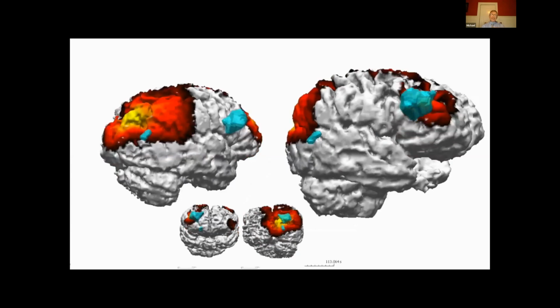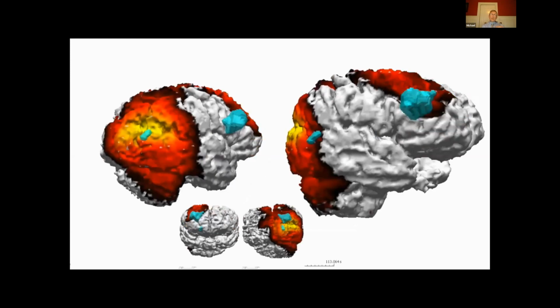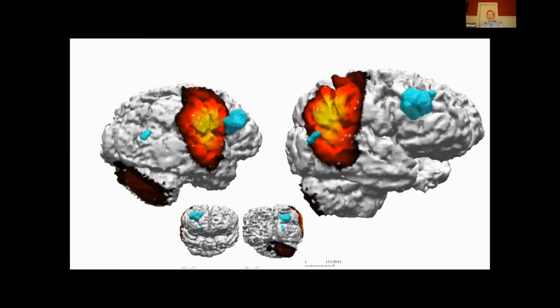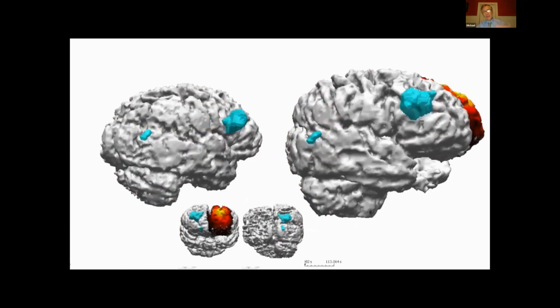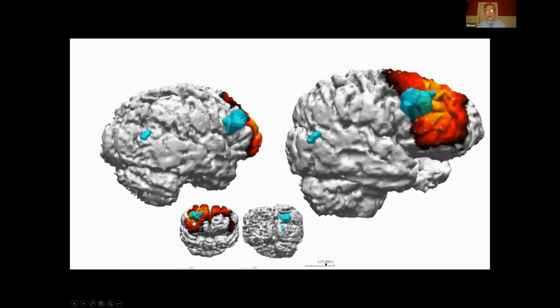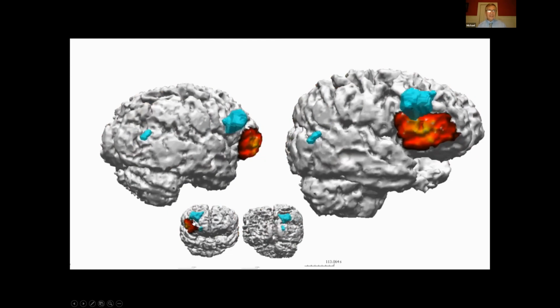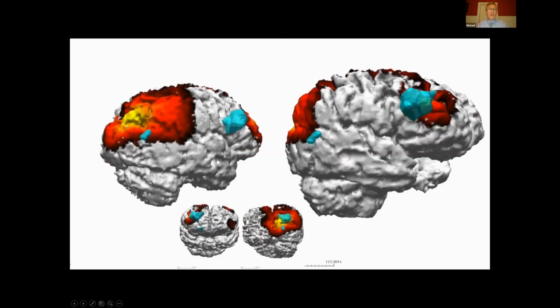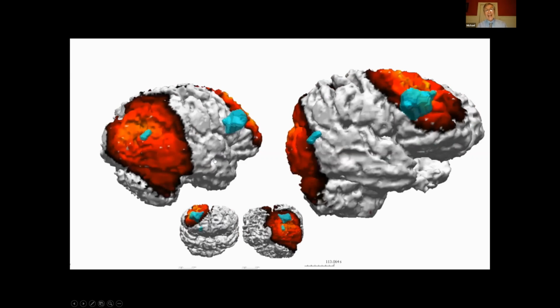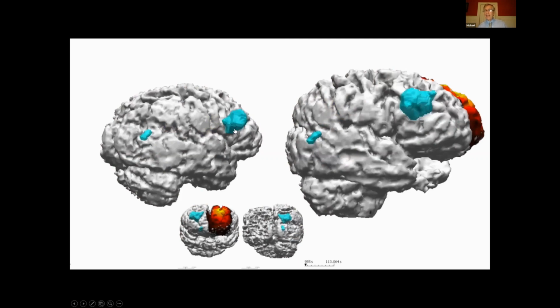The blue dots represent the fMRI denoted areas of increased activation, and the red yellow are those EEG patterns that are sweeping across the brain. And as you watch this video loop around, you'll notice that the EEG pattern is actually co-localized right over top of the fMRI patterns of increased brain activity. So we think what we're seeing is as the person is beginning the task, the occipital region is activating as they're envisioning the task. The EEG waves sweep up across the motor prefrontal premotor cortex, then localize right over the right prefrontal cortex, which is that area of risk-taking and gambling activity.